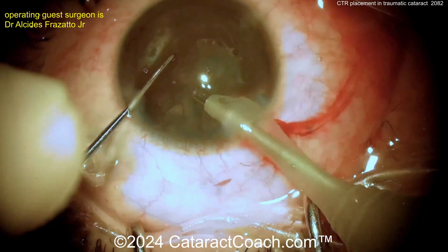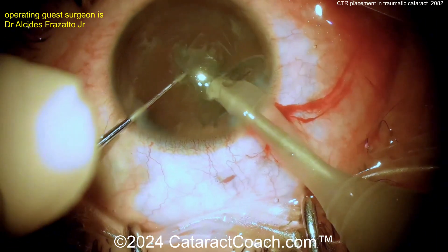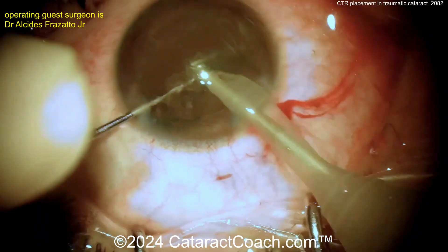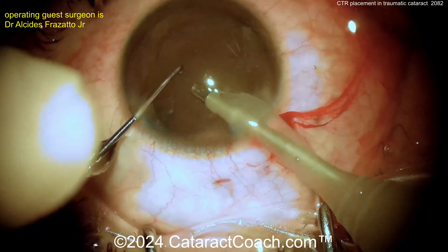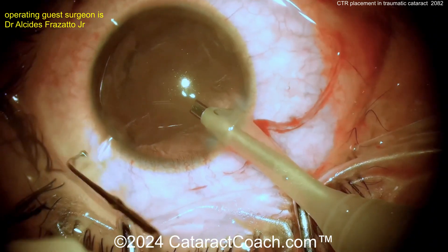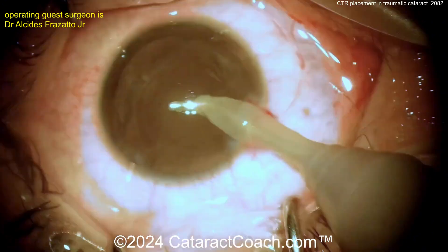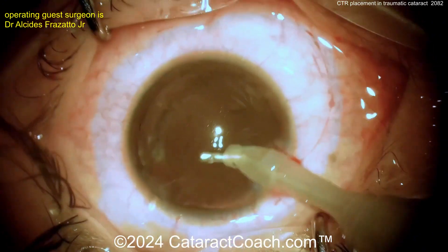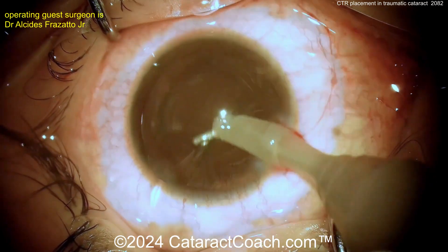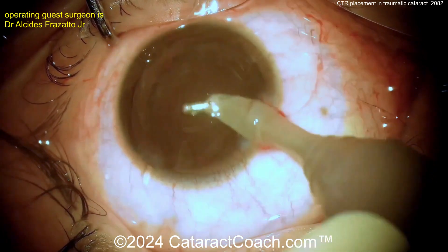Nuclear removal is pretty easy — not a very dense cataract. One of these traditional traumatic cataracts, probably in a young person. Taking out that cataract pretty easily — there's the nuclear removal. And now we can examine more of the capsular bag in detail as we do the cortex removal. That came out pretty nicely. Here's the IA probe going inside the eye. It looks to be pretty reasonable — so maybe only a little bit of zonular weakness. I think you're going to be okay just getting your regular lens in the capsular bag here.